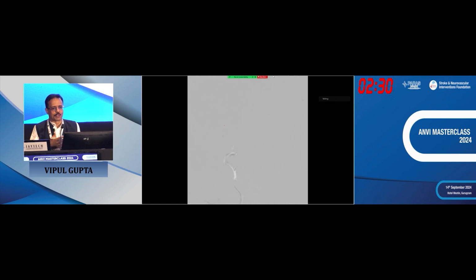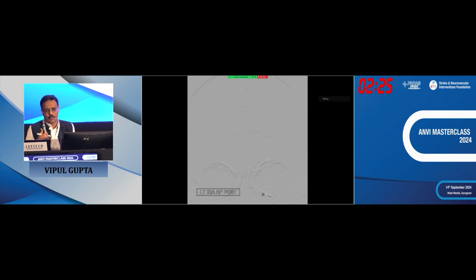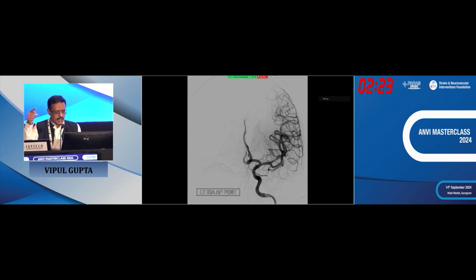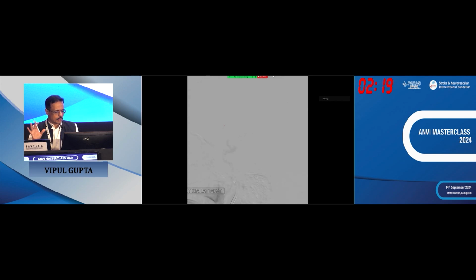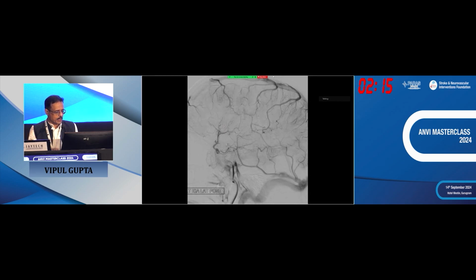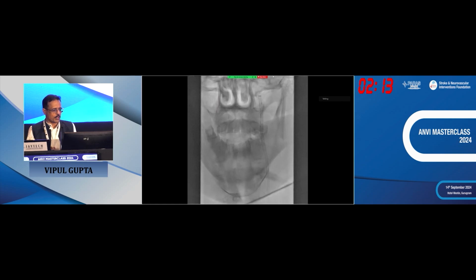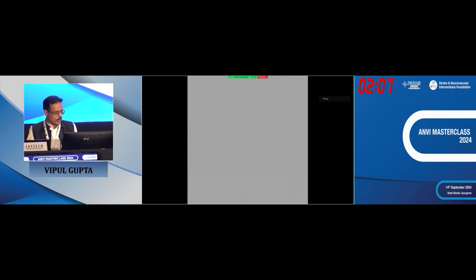And now the question which we were discussing, to stent or not, what to do with the lesion here. Since we were suspecting dissection, you could see the artery is probably loopy. And we were happy there was no major embolism. The ACOM is patent. Most of the arteries are patent. We have already checked there was a great ACOM in this patient. Okay. And doing aspiration, yes, we aspirated when we brought it out.